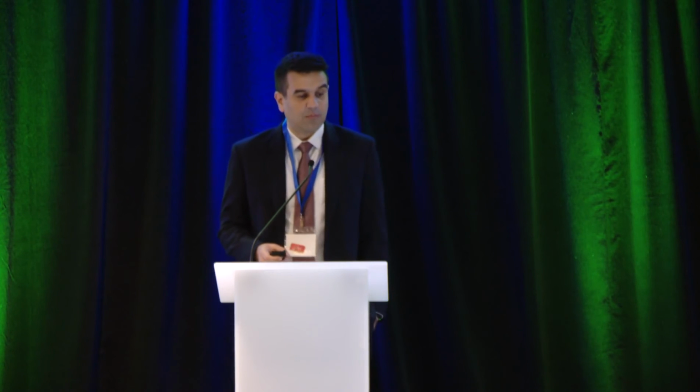Just a friendly reminder, this really applies to patients with normal foregut anatomy in terms of the specific metrics, without prior surgical or invasive foregut intervention and without large hernias or paraesophageal hernias. And endoscopic or radiographic evidence of obstruction can preclude using some of the specific metrics of Chicago 4.0.